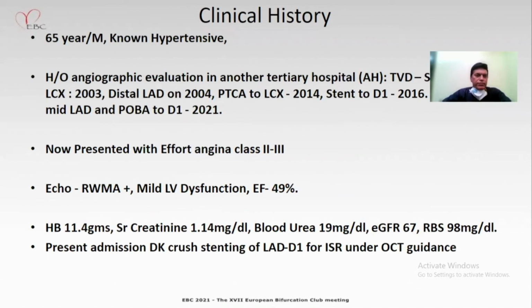This is a 65-year-old gentleman, known hypertensive. He underwent multiple interventions. Presently he was admitted for PCI of ISR of the LAD-D1 bifurcation site under OCT guidance.